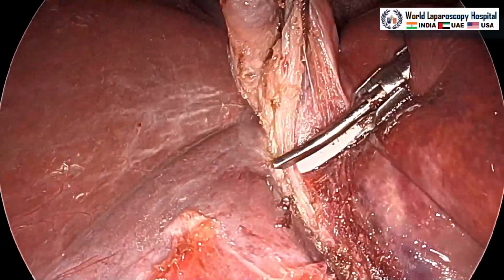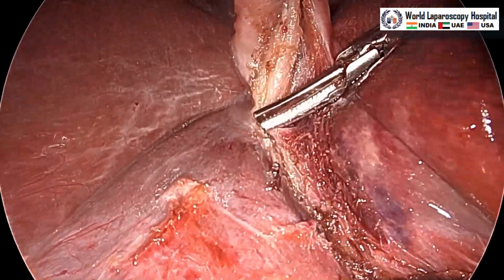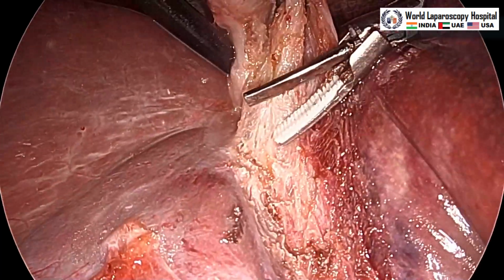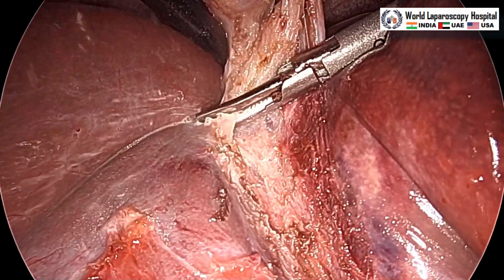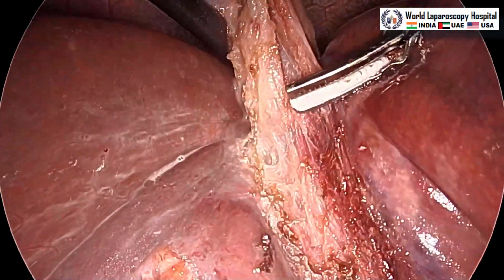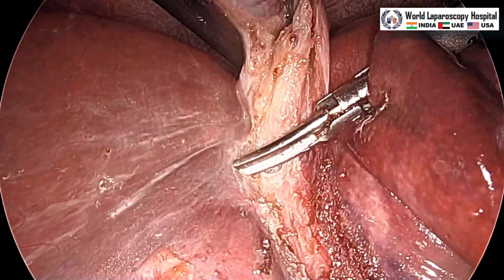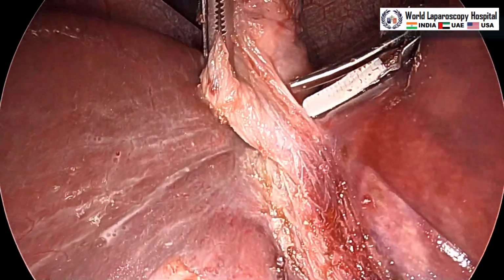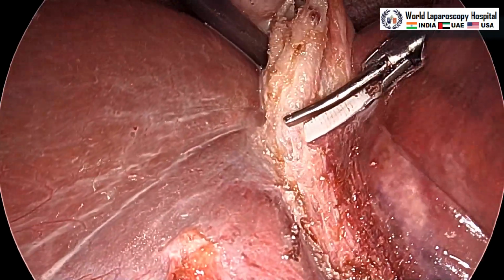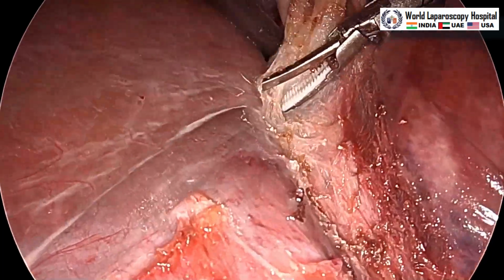After cholecystectomy, here we will perform the ovarian drilling also, because this patient has polycystic ovarian disease, and previous episodes of appendicitis were also described by the patient. So, she has opted for appendectomy also. She wants that we should remove the appendix also. So, although clomiphene citrate has been given before, she wants ovarian drilling also because of the polycystic ovarian syndrome.